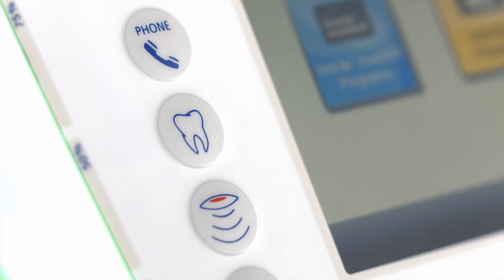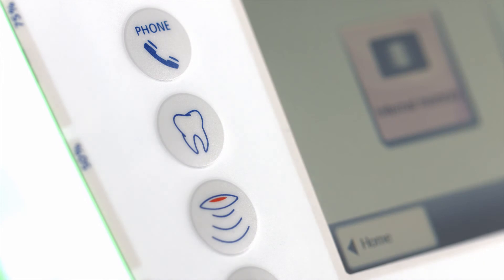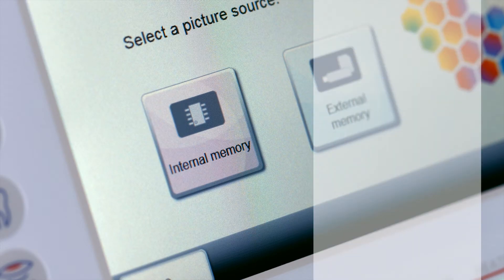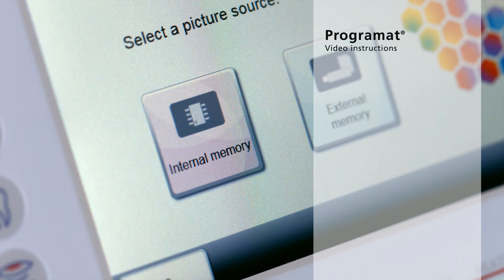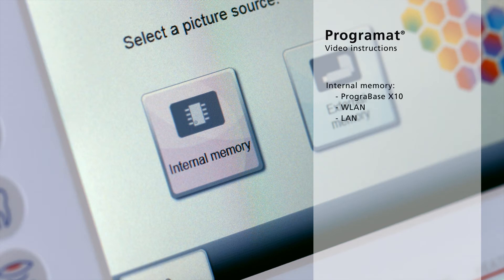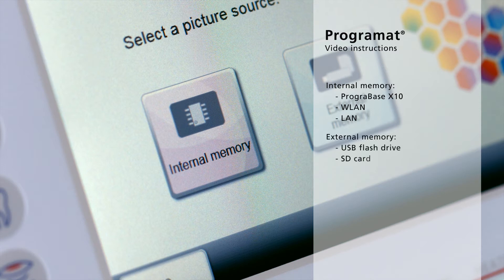Press the digital shade assistant button on the membrane-sealed keypad of the furnace. There are different options for uploading the pictures onto the furnace. If the photographs are transferred to the furnace by means of the Prograbase X10 computer software via a Wi-Fi or LAN connection, they are stored in the internal memory of the furnace. If you use an external data carrier such as a USB stick or SD card, you will find them in the external memory.